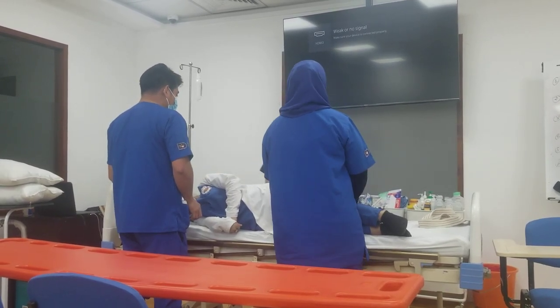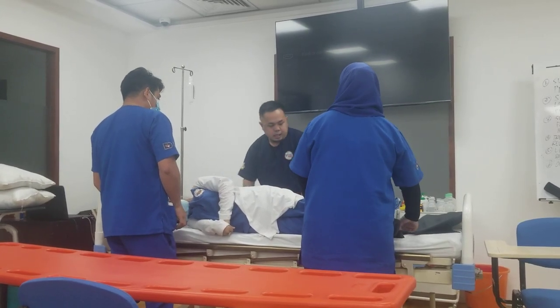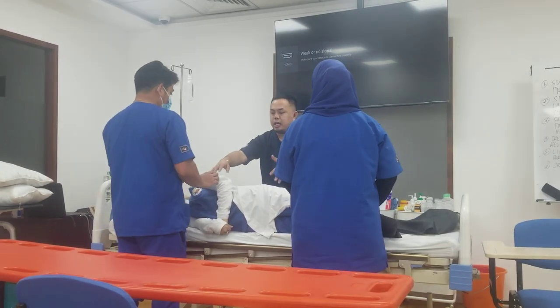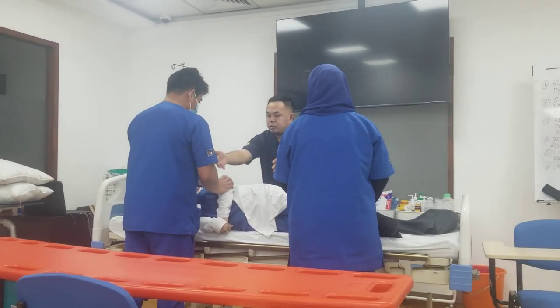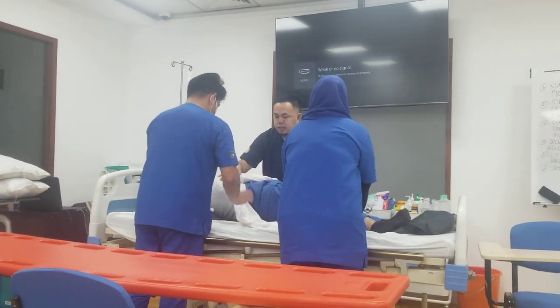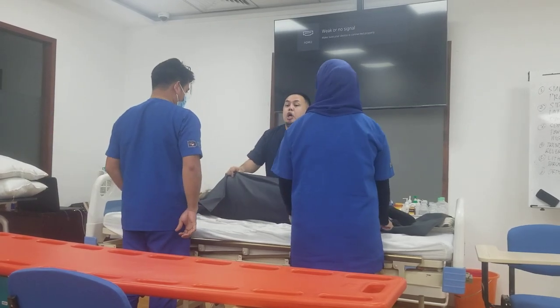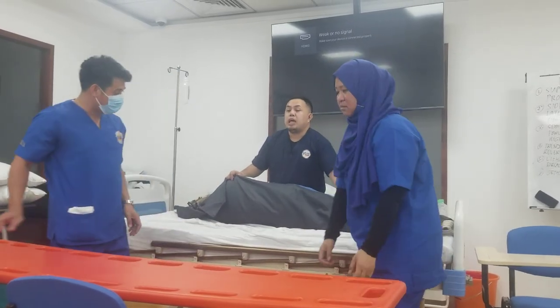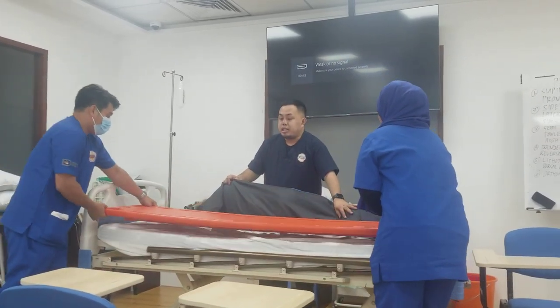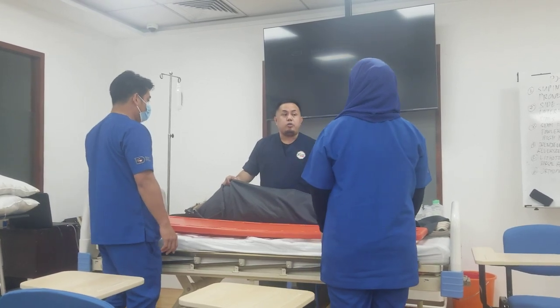Tell your colleague: 'Would you mind rolling the patient towards me?' Hold the patient while also holding the sheet. Then tell your colleague: 'Would you mind taking the transfer board — the stretcher board — and sliding your board onto the bed?'